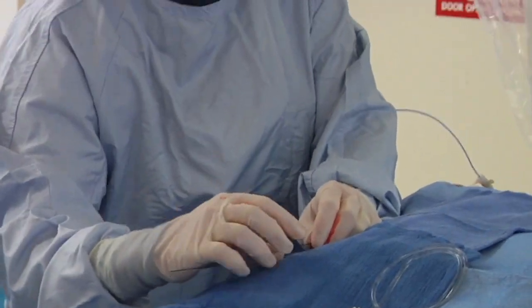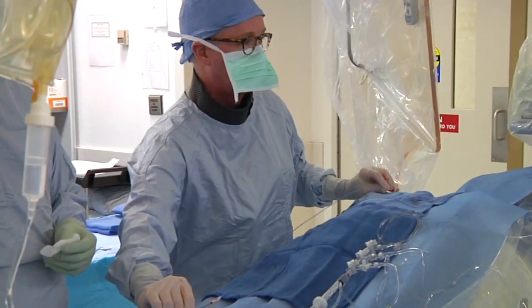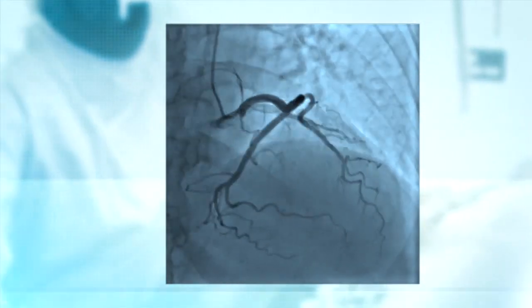The catheter is then advanced through the sheath and guided to the heart, and the coronary angiogram and stent placement, if necessary, is performed.